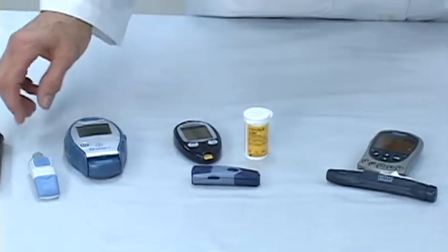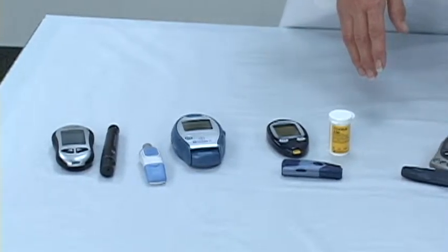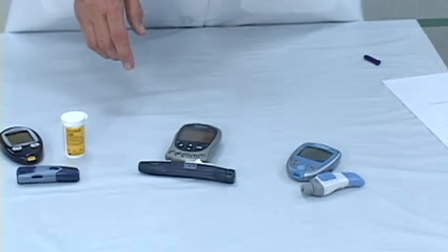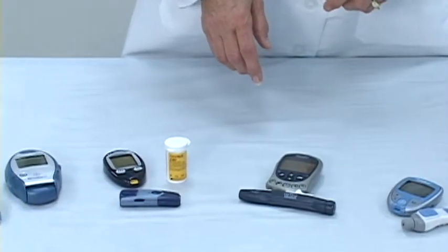All the lancet devices are adjustable so that you can change the depth of your poking device. So if your blood droplet is too large, you can go to a smaller depth, and if your blood sugar droplet is too small, you can go to a deeper depth.